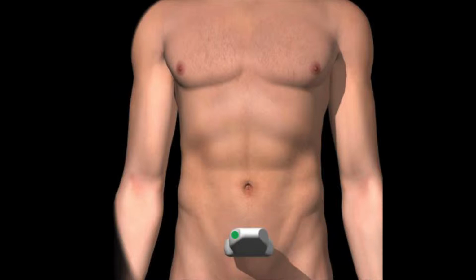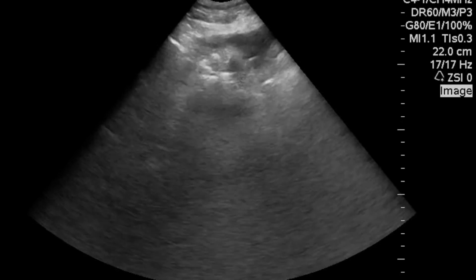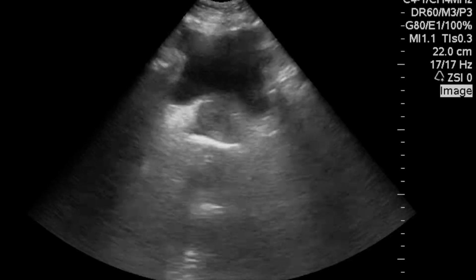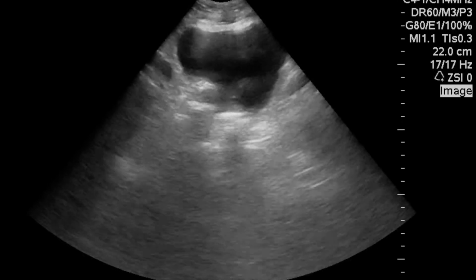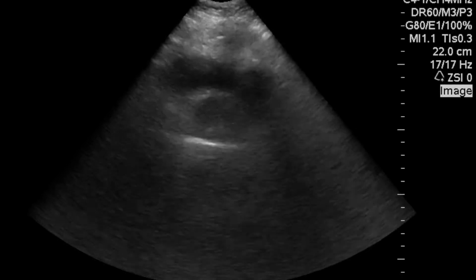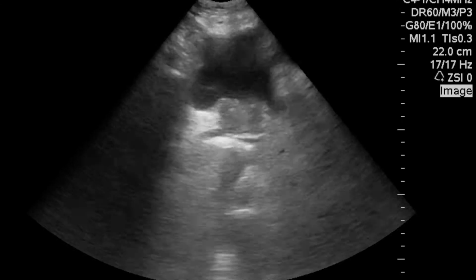The indicator goes to the patient's right, and we will fan through the pelvis, looking again around the bladder for free fluid. As you can see in this normal scan, the bladder's in the center of the screen. It's anechoic. You can see a little bit of posterior acoustic enhancement of the tissue below the bladder, since I've not turned down the far field gain yet. And looking to the left and right of the bladder as we scan through it, we don't see any sharp anechoic fluid collections that in the setting of trauma would be considered blood.